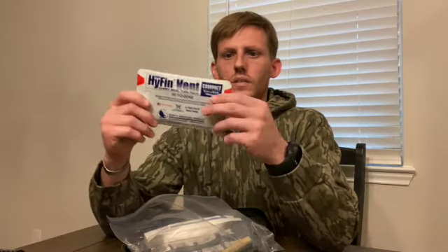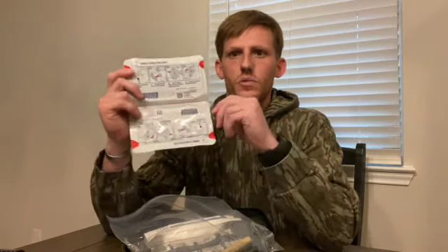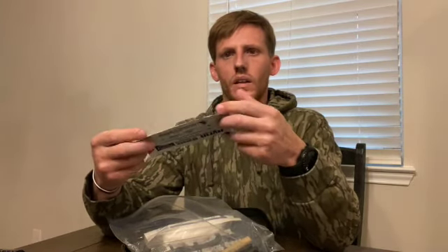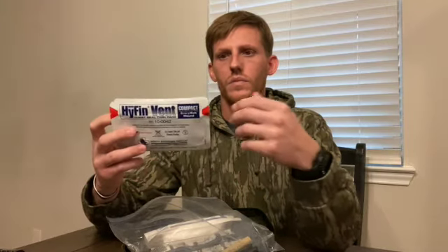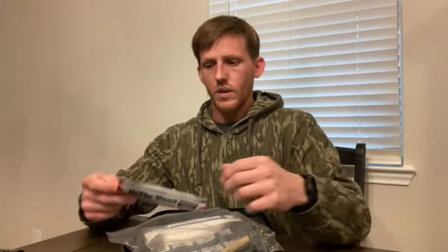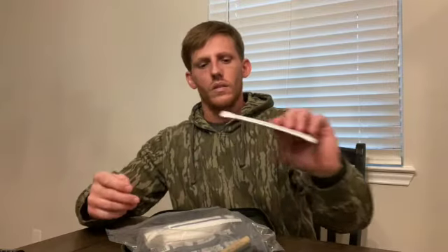Next we got a set of chest seals — occlusive dressings, otherwise known as chest seals. The use is in the name. This is a twin pack, so this would be for an entry and an exit wound. Let's say you have a gunshot wound to the torso, through and through — you would seal off the front and seal off the back. It basically stops air from entering the cavity and prevents a tension pneumothorax.